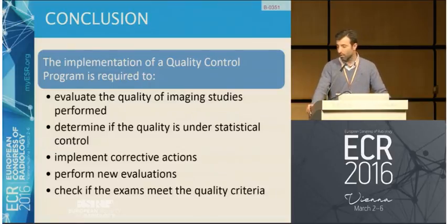The implementation of a quality control program is required to evaluate the quality of imaging studies performed, determine if the quality is under statistical control, implement corrective actions, perform new evaluations, and check if the exams meet the quality criteria.